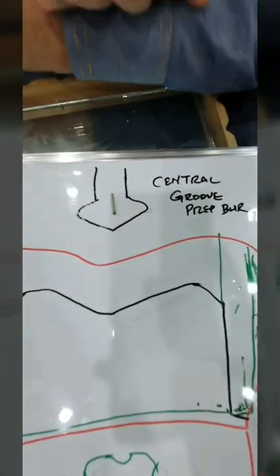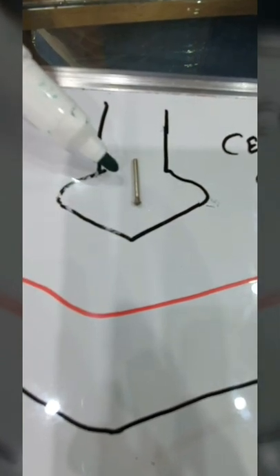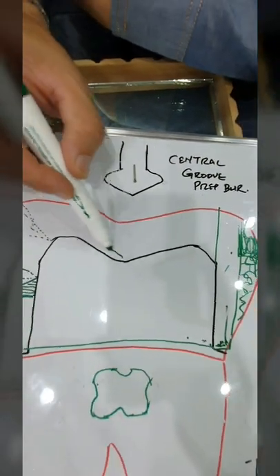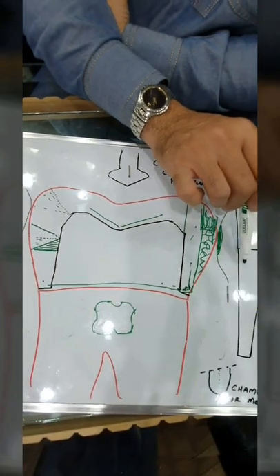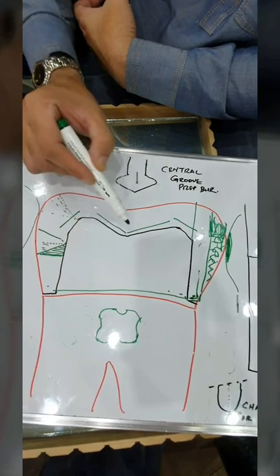This is a nice acorn type of burr, and as we're showing you the close-up of it, this is the outline of the burr. It is pointed, it's like a spinner. Beyblade is what kids used to play with about 10 years ago. It has the same tip, rotating tip, and you can use that to cut a very nice groove in the center, and it would give you both of these slopes very easily. Then you can use the same burr that we were using for the margin prep to do the sides like this and blend everything in.